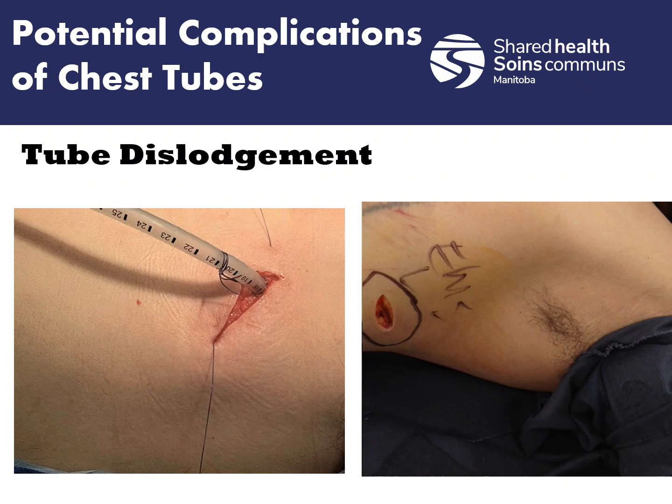But if the chest tube does come out, this is a big emergency, because now we basically have a giant hole there. So we treat it just like we would any trauma patient with a large hole in their chest. We're going to cover it with our hand right away, and we're going to stick a chest seal over top, or at least an occlusive dressing over top, to prevent any air getting into the thoracic cavity. And we're going to redirect to the closest open facility.